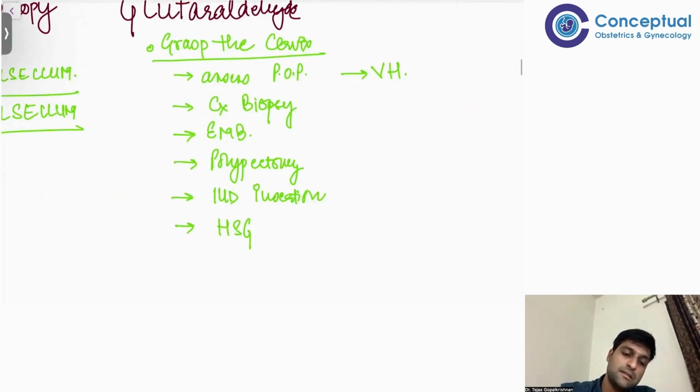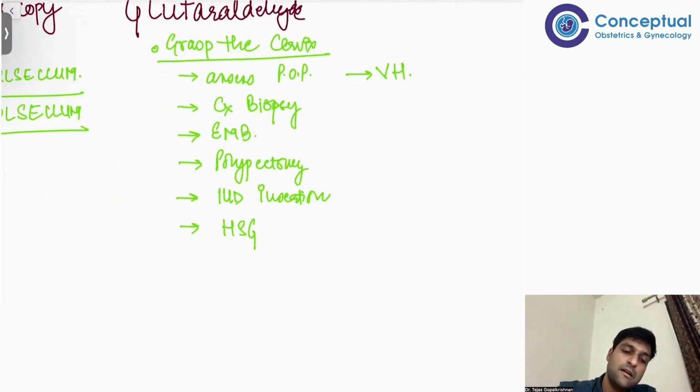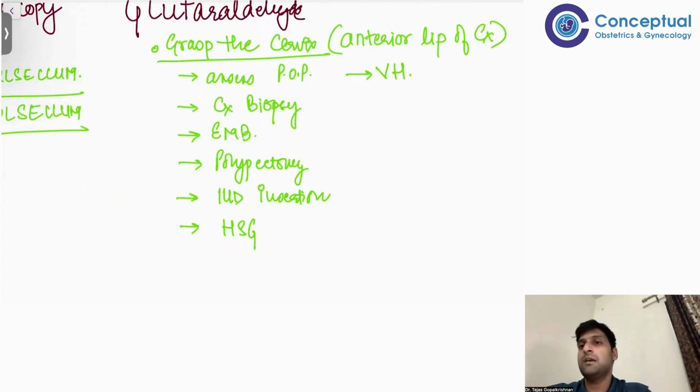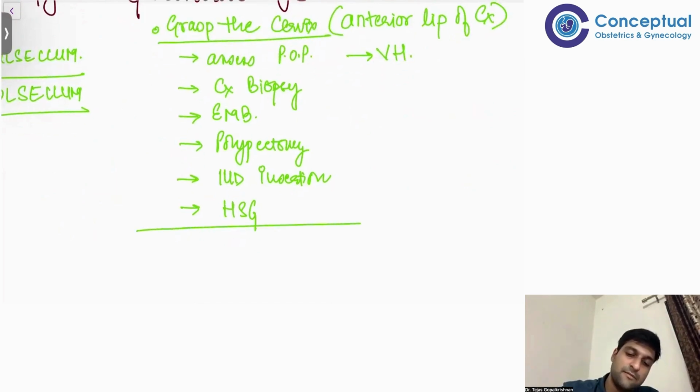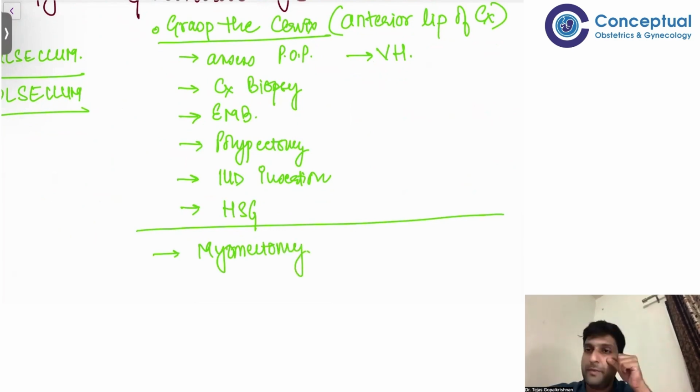So whenever we are grasping the cervix, we are grasping the anterior lip of the cervix, right? So by grasping the anterior lip of the cervix, we are doing all of these procedures. Apart from that, without grasping the cervix, some other use, out of the track use, offbeat use, it is used in myomectomy, right? Now that we know the use, let us go back and see its orientation.